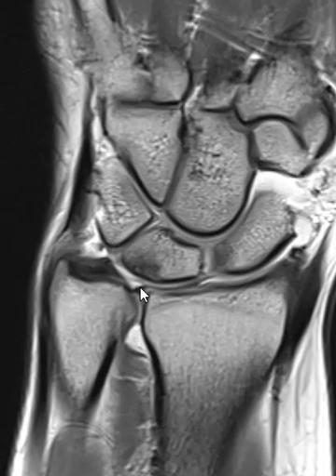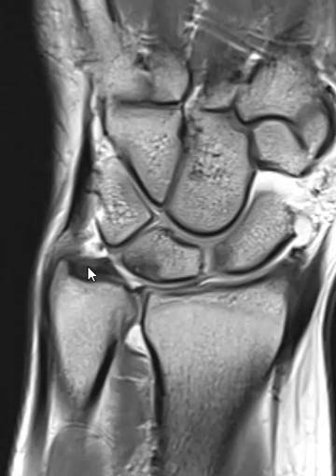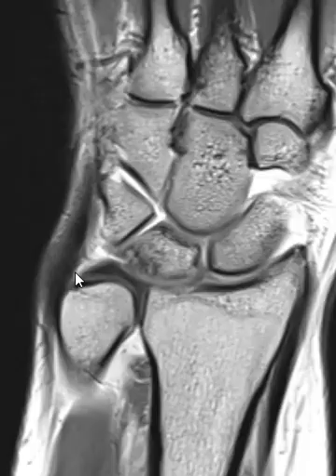Over here we see the TFCC coming across. Right in the very central portion we see the central disc, and the central disc does not look normal — it looks pretty thick. Over here it comes to the foveal attachment, and up here at the top the styloid process there's a styloid attachment. This whole area looks dark.